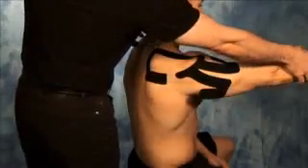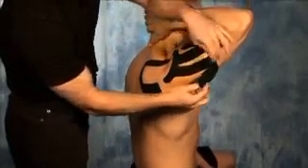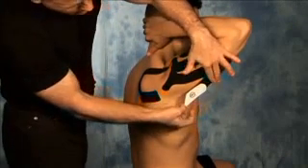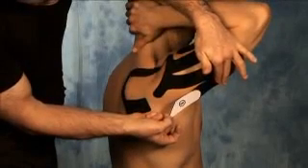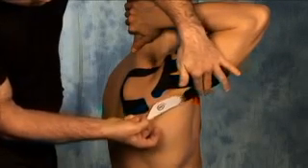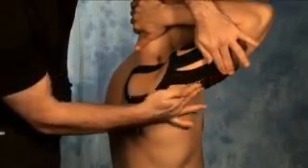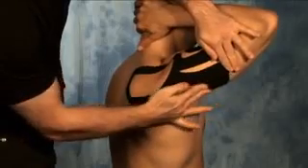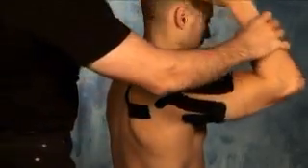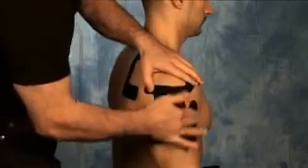The final portion is bringing the hand back behind the head to stretch out the tricep muscle group. Peel the backing of the tape, letting it come in gentle contact with the back portion of the upper arm along the tricep, without any stretch on the tape. Once applied, gently rub in to activate the glue. Once the shoulder slider is applied, rub over top to ensure all areas are properly applied and that the glue is activated.